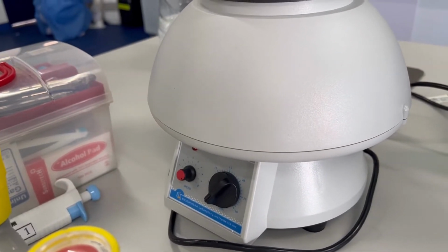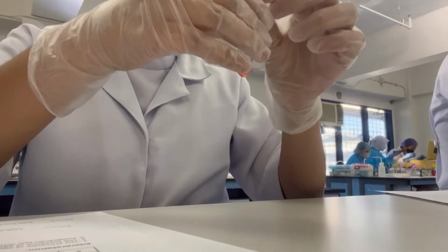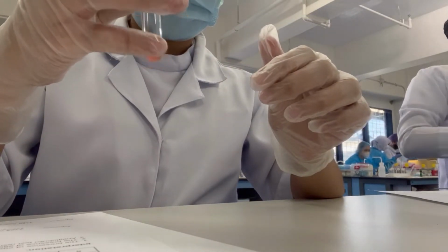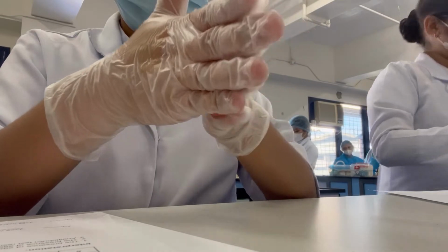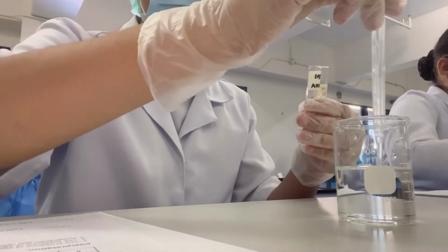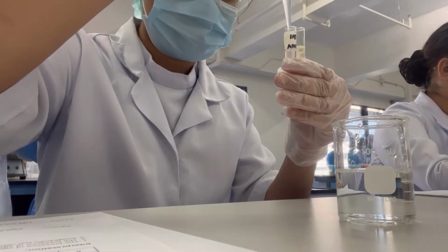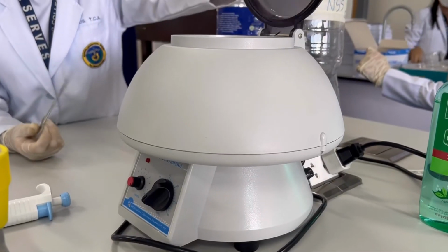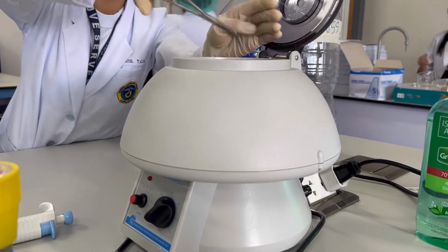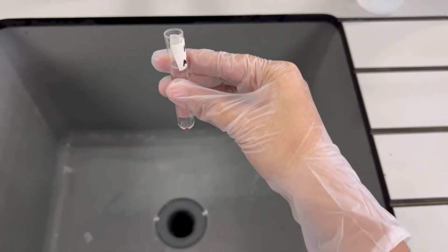Centrifuge the tube for 30 seconds at 3,400 rpm. After centrifugation, resuspend the cell pellet by gently tipping and rolling the tube. Wash each tube 3 times with normal saline solution. And completely decant the final wash.